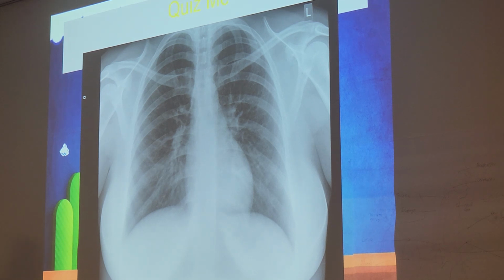What's wrong with that marker? It's digital. It's a digital marker. The reason I harp on that a lot is it's something they're going to throw at you likely in your test, guys. We don't ever use digital markers unless we're just in a hurry, right? Do we ever use digital markers? No, we should not. It must be a physical marker.